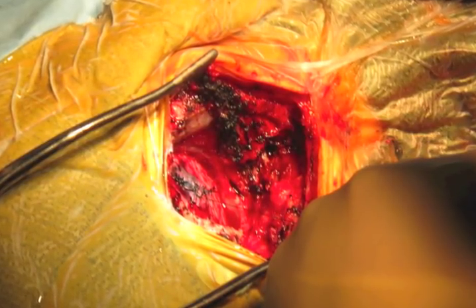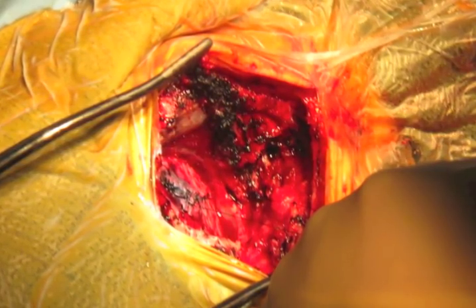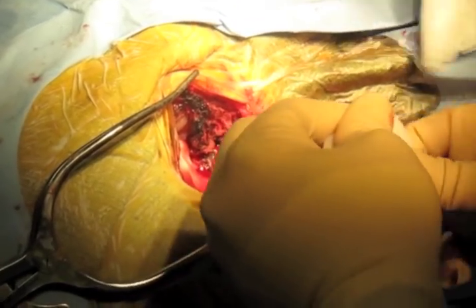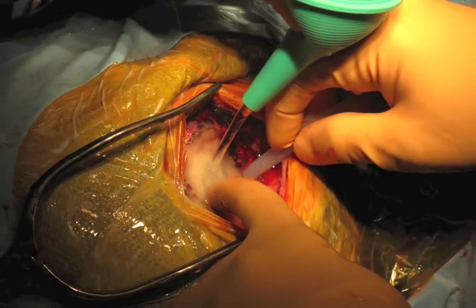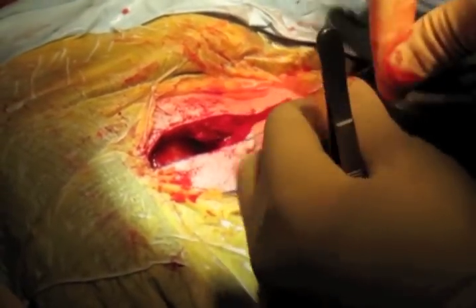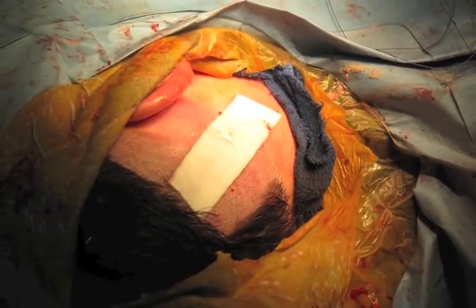Closure of a retrosigmoid craniectomy begins after meticulous intracranial hemostasis has been obtained. Primary dural closure is attempted using 4-0 silk sutures. Duraseal and/or a synthetic dural substitute are applied prior to performing a cranioplasty with methyl methacrylate and wire mesh. The wound is copiously irrigated to remove debris and devitalized tissue. Zero-Vicryl interrupted sutures are used to create a tight fascial closure. Subdermal sutures are then placed with 3-0 Vicryl and the skin is approximated with staples. The wound is properly dressed with Bacitracin ointment, Telfa, and Tegaderm.